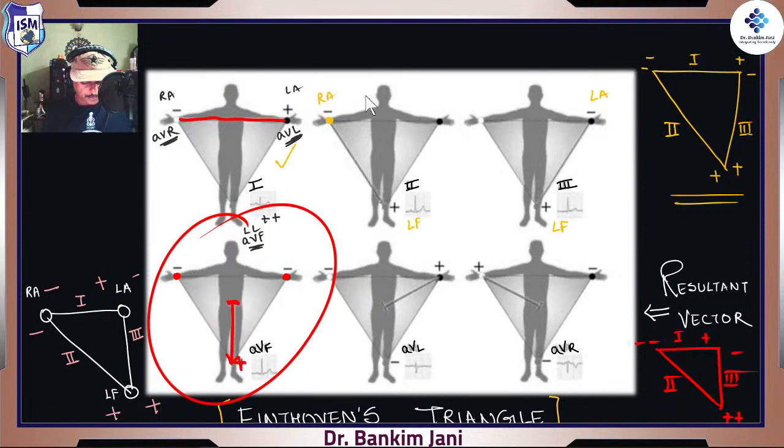So because we are positive over here, right? When we are positive, it means whatever the current which is coming towards the foot is what will watch. Getting it? Right? The current which is coming towards the foot, only that current would be watched. But with respect to what? With respect to rest of the two electrodes. So that's the reason that one angle is this, second angle is this, but the resultant is in between what we are getting over here. Same logic, exactly the same logic.